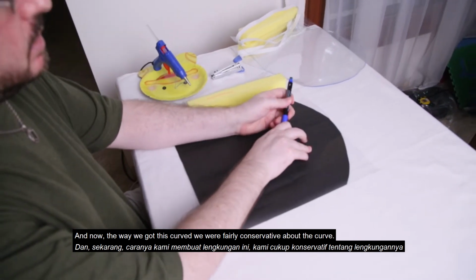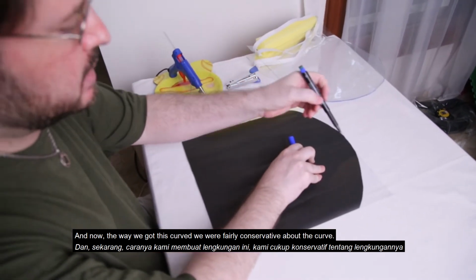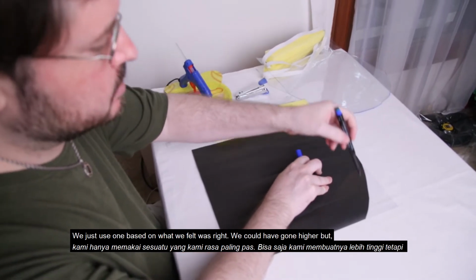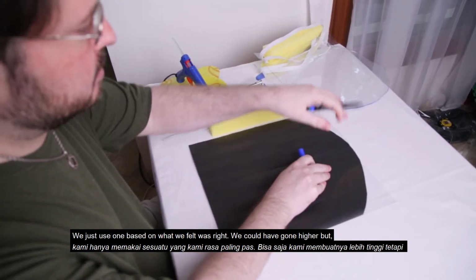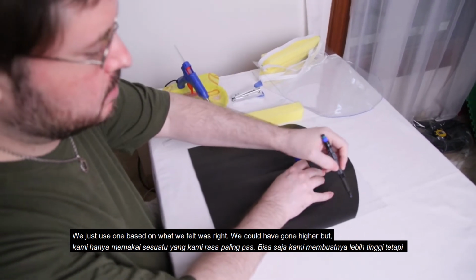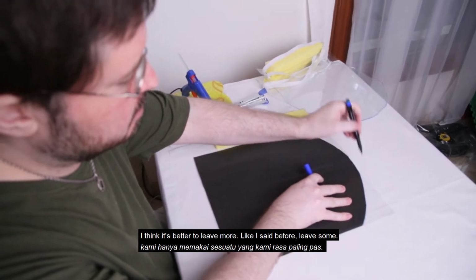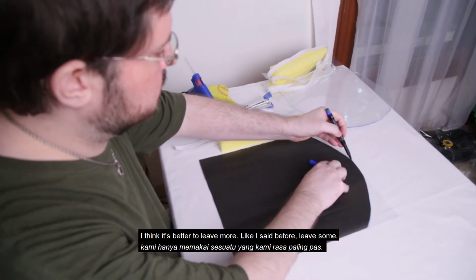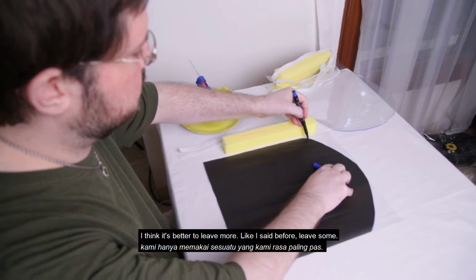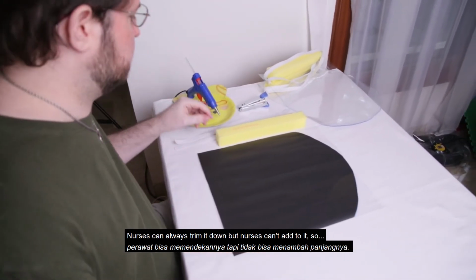Now, the way we got this curve, we were fairly conservative about the curve. We just used one based on what we felt was right. We could have gone higher, but I think it's better to, like I said before, leave some. Nurses can always trim it down, but nurses can't add to it.